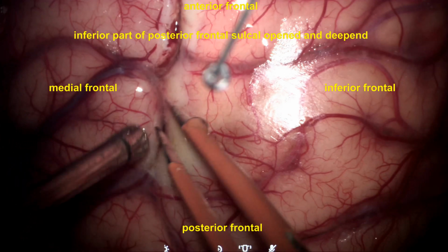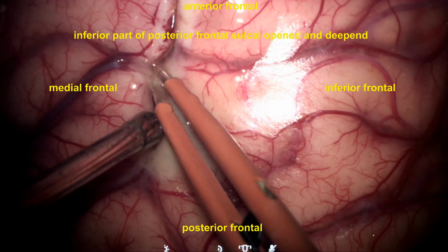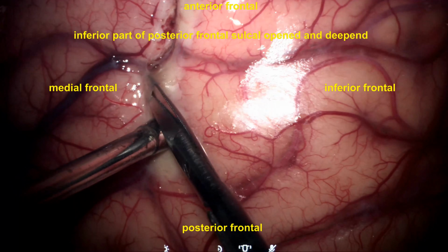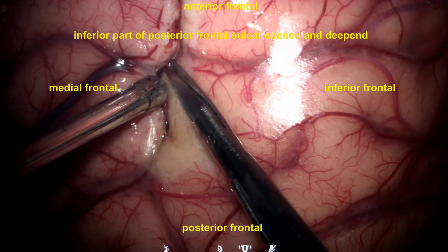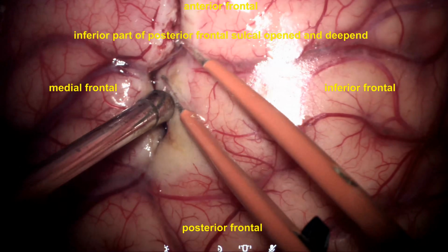These are the points we should look for when operating on lesions situated in vital areas: widening of the gyri, paleness or redness of the gyri, and change in the gyri suggest the underlying location of the tumor.